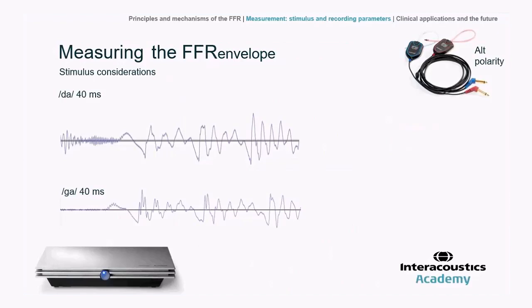And because also the tube allows a delay to differentiate an artifact from a true response, and of course the ability to do a no-sound trial quite easily. I'll show you that in just a moment. Use of an alternating stimulus might be desirable to try and cancel or minimize contributions like spectral FFR or cochlear microphonics, etc., from the neural sources here that we're interested in.